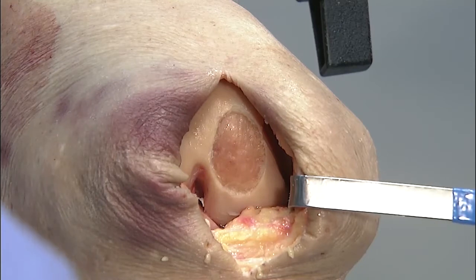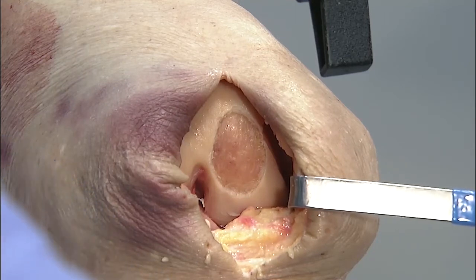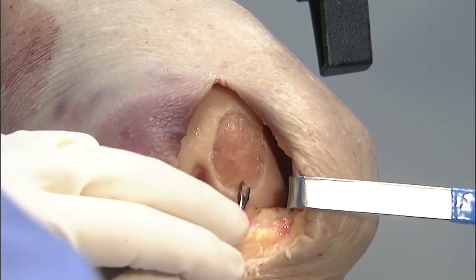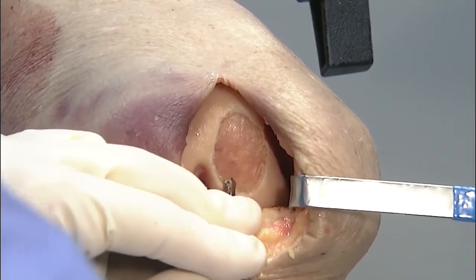And just not to harp on it too much, but to give you an idea, the calcified cartilage layer is less than 0.1 millimeters thick. And some of the people that pioneered how we know to remove it, like Frisbee and McIlwraith, did it on over 50 to 60 sheep and had to do histology on all those to really get good at it, to remove just that portion. So it's tricky, but it's an important part.